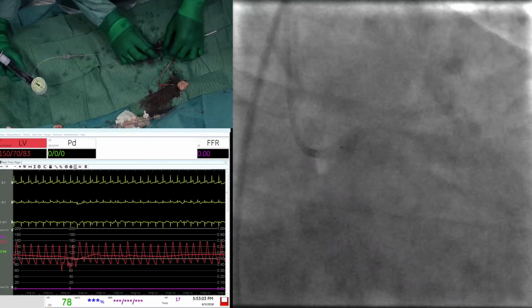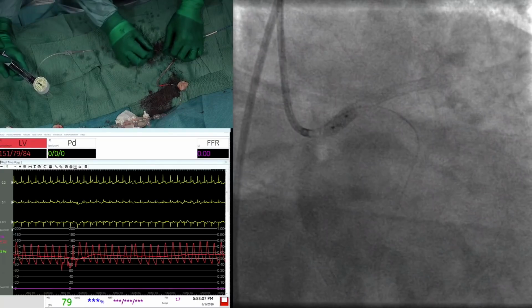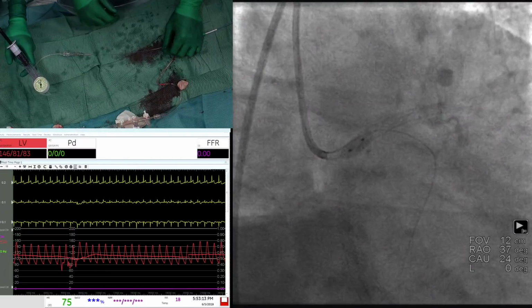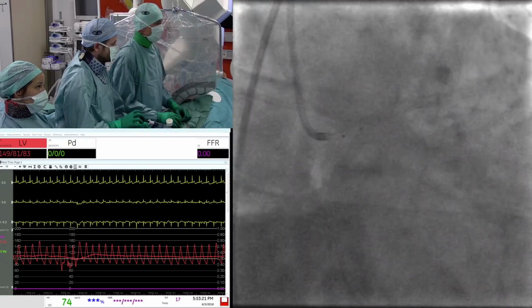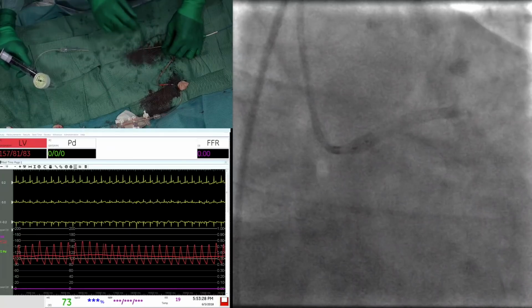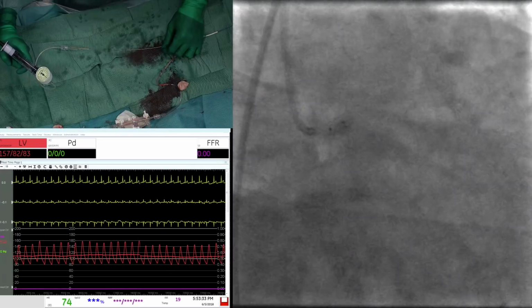The guiding is, well, the left main is not that big. I will pull back the 14, 16. Okay, so this is now serious stuff, huh? 4 millimeter to 16. We're almost at 4.5 or 4.25. We will do also the ostium because we know the ostium is covered. Yes, go. And then we'll have a look again.